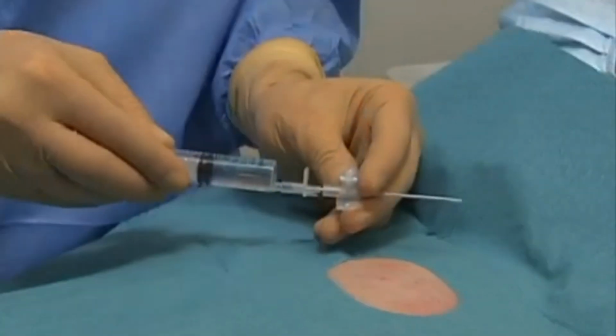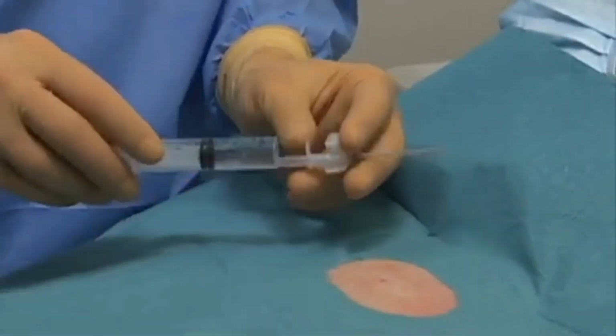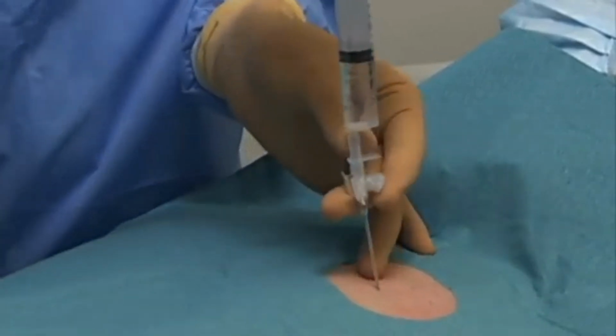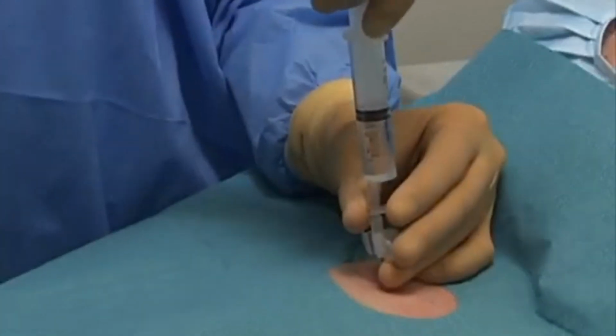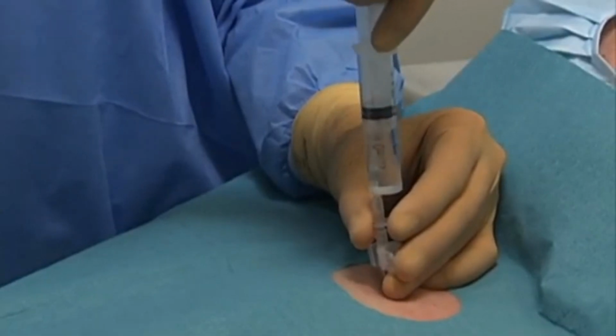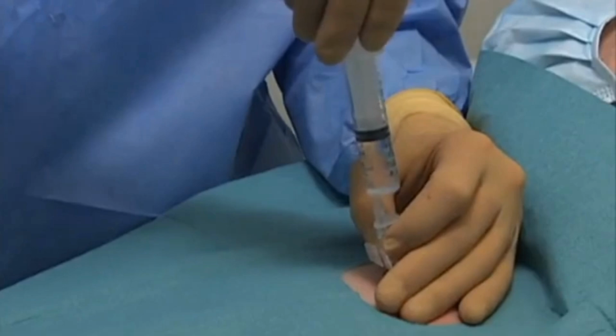When you insert the over-the-needle catheter, connect it to the 10 milliliter lidocaine syringe, which should be partially filled with the remainder of the local anesthetic. Stabilize the skin with the non-dominant hand and puncture the skin with the catheter using the same landmarks that you used for the local anesthetic. Continue to aspirate with the syringe, slowly progressing in the direction of the pleural space. Again, when the needle penetrates the pleural space, air bubbles will appear in the syringe.